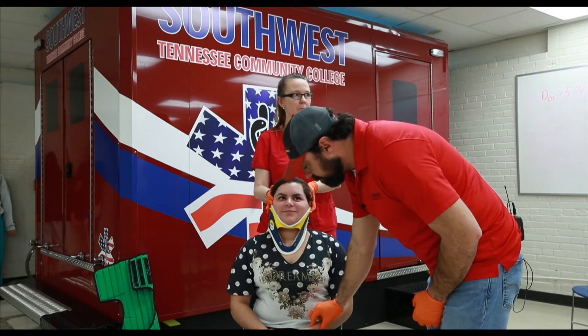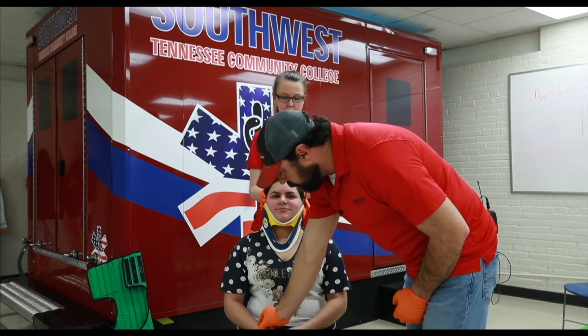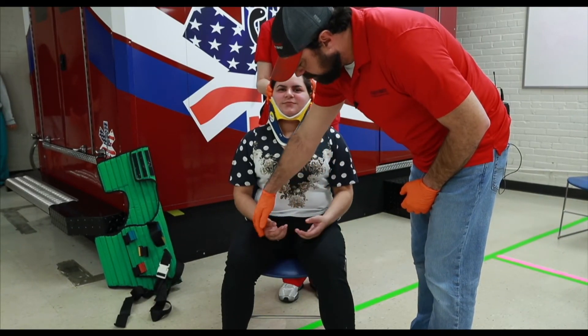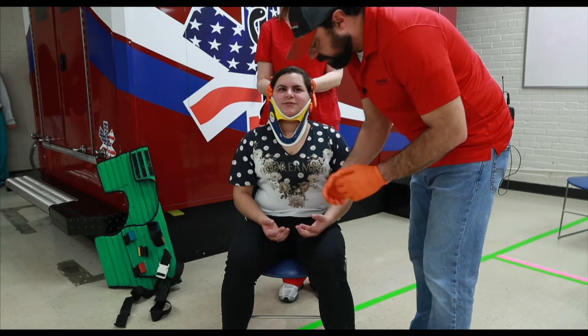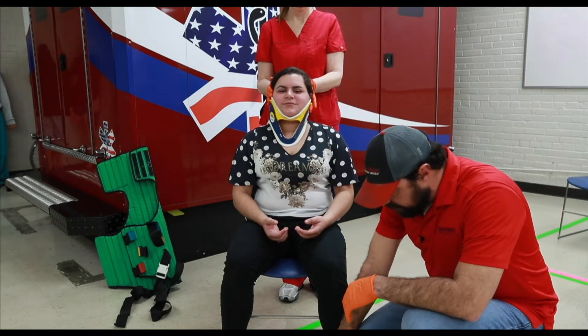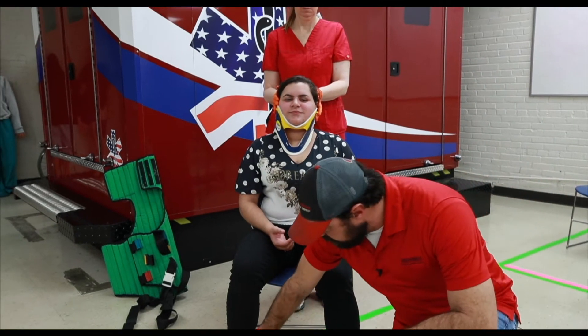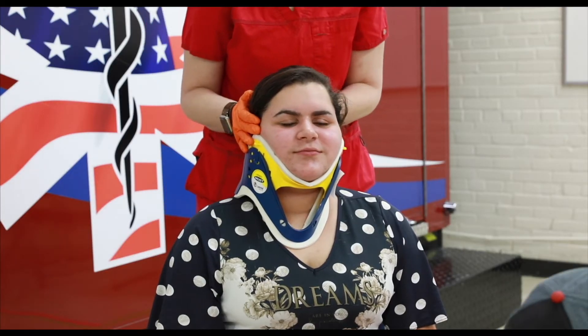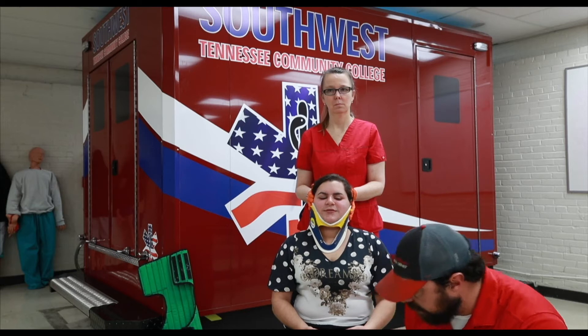At this time, I'm going to go ahead and check pulse motor sensory of all four extremities. Can you feel me touching you? Can you move your fingers? Going down to the lower extremities, we're feeling for pulses. Can you feel me touching you down here? Can you move your feet? Very good.